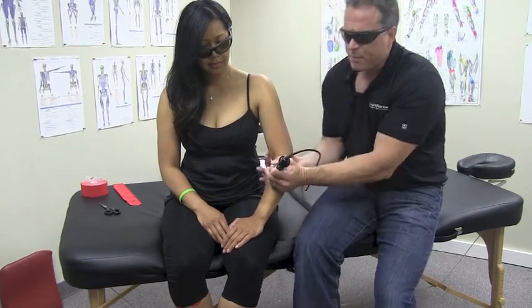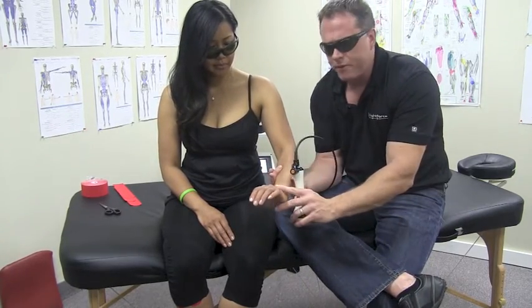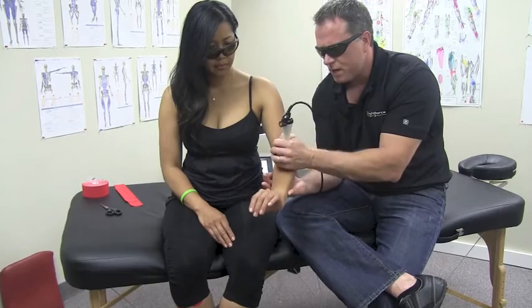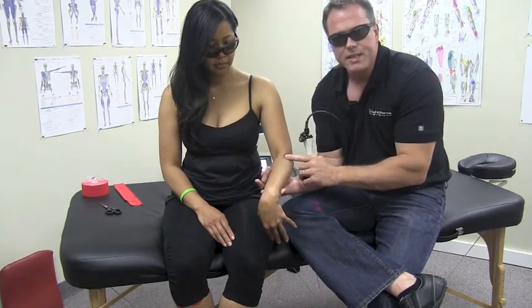I'll also have the patient do some flexion and extension with the wrist — she'll go into extension to what's comfortable and then go down into flexion as I'm going through the forearm muscles as well. Make sure you go all the way down to the wrist.